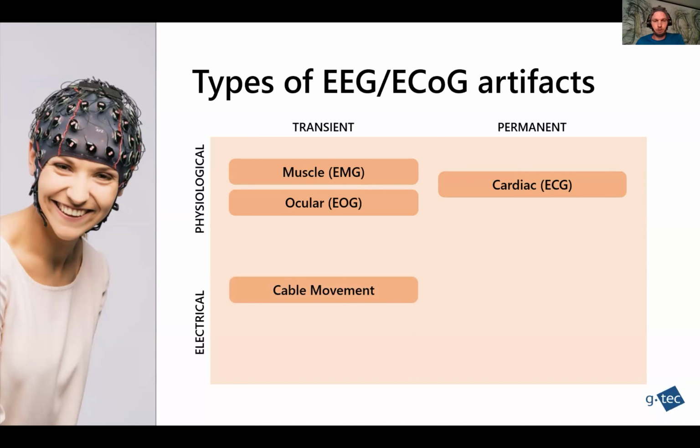And then when you're not doing the measurement properly, or when you're doing the measurement in an environment where you are required to move, for example, when you're cycling or doing exercises, then in these cases it's unavoidable to have cable movement artifacts. These are usually very large amplitude artifacts. And of course, there are also sources that are not physiological but electrical. When you charge up something and you get discharges, of course, this is also captured when you're recording biosignals in those channels.